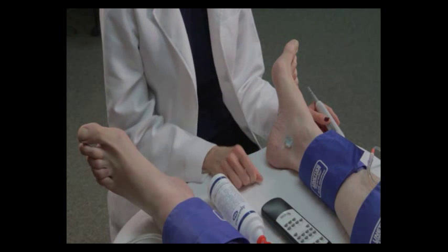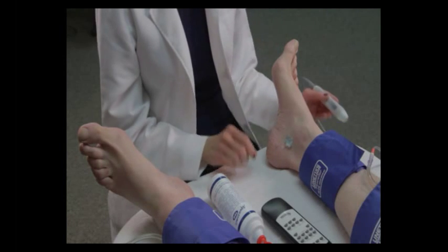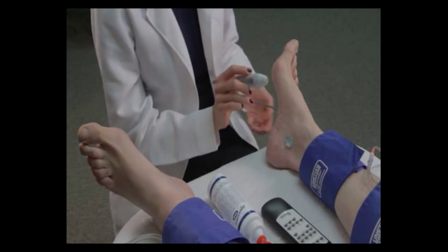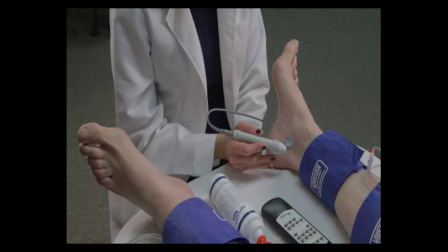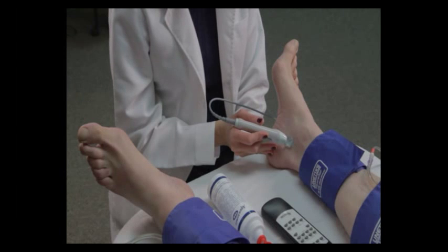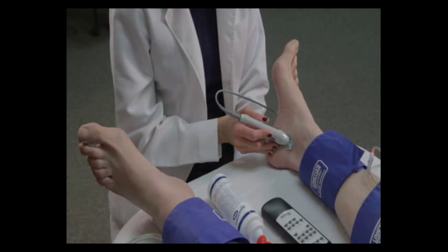This is one area where it can be a little tricky maintaining that 45-degree angle. Most of the places on the body, the vessel is going to be parallel to the skin surface. In the posterior tibial artery, sometimes that artery is going to present itself at 45 degrees when the probe is perpendicular to the skin. So even though it's going to look wrong, it may be correct. Your eyes and your ears will tell you when you have the right value.